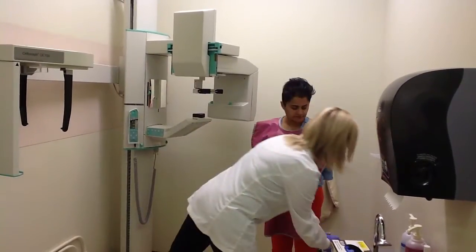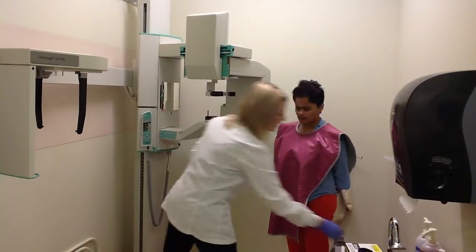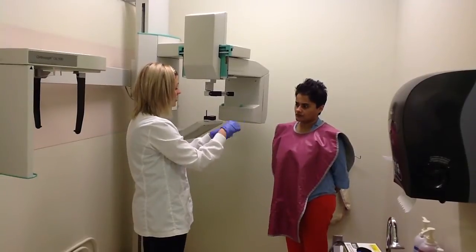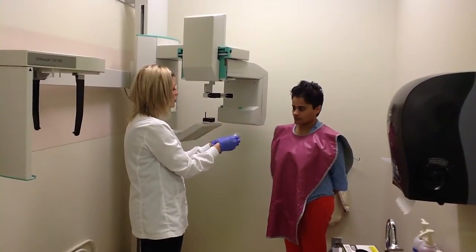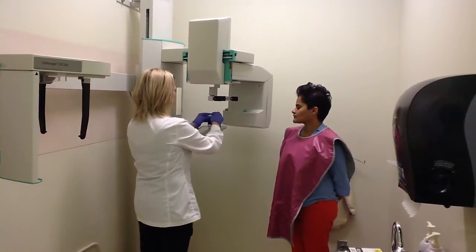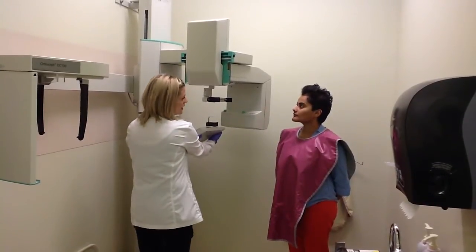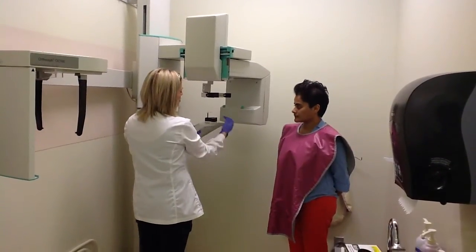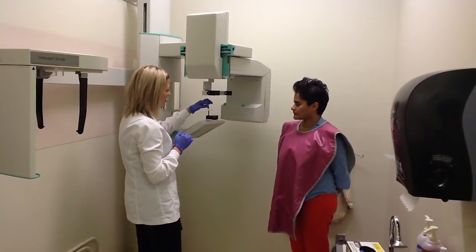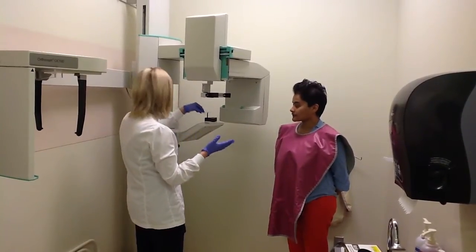So I'm going to put one of the positioning sticks in, and this is the little plastic piece that I'll have you bite on, okay? It's disposable, so I'm opening up a new one for you. And I'm just going to place it here. So what you can expect, I'm going to have you hold on to these handles, okay? And then you'll be resting your chin on this black platform, and then you'll be biting on this bite stick right in this groove with your two front teeth. Okay? I'll help you and guide you through it.